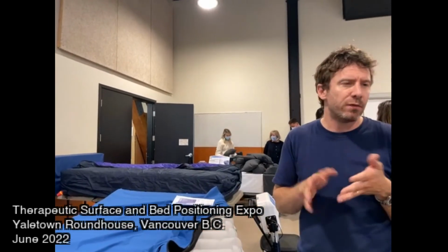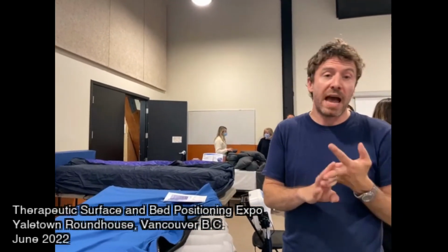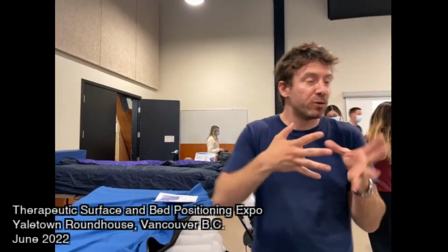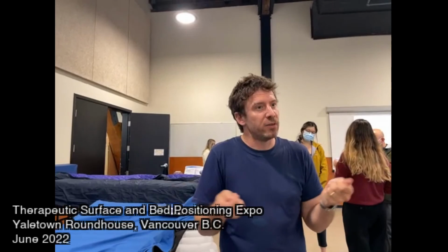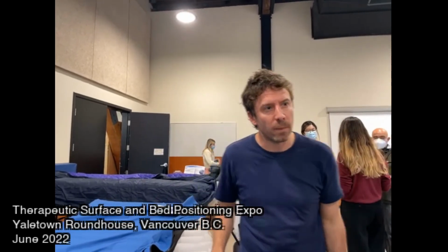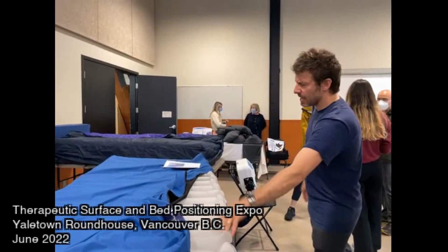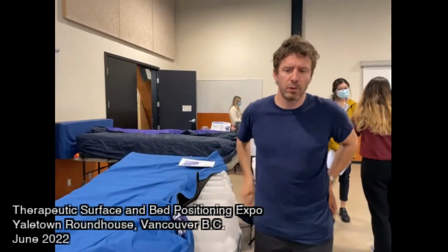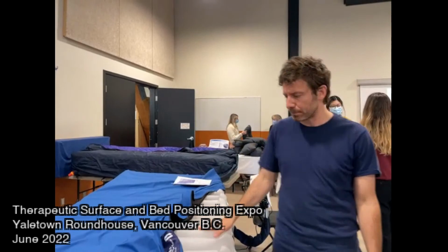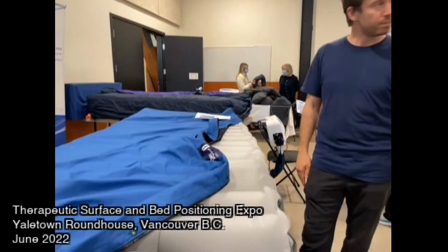And that could be really good for frail patients, for pediatrics, but ironically also for bariatrics, because there are more air cells to help offload. So that one has more than this one? Yeah, this is 18. This is 21. Oh, okay. So slightly more in the larger surface.